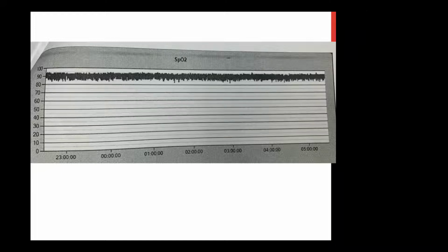It doesn't even look like there's a REM period breaking it up. So maybe some type of medication-induced central sleep apnea, something that seems kind of metabolic in the sense of being very regular. So that or some hypoventilation, maybe, I'm not sure.